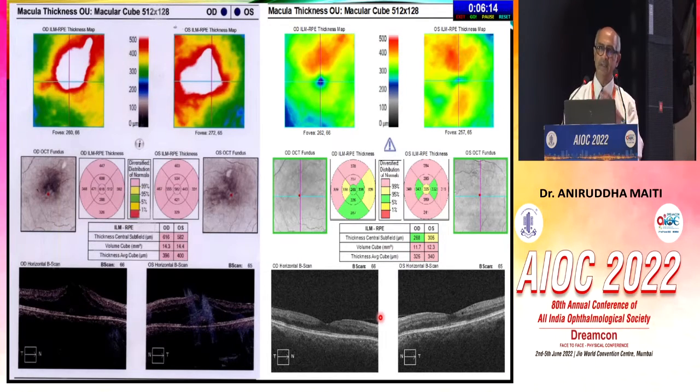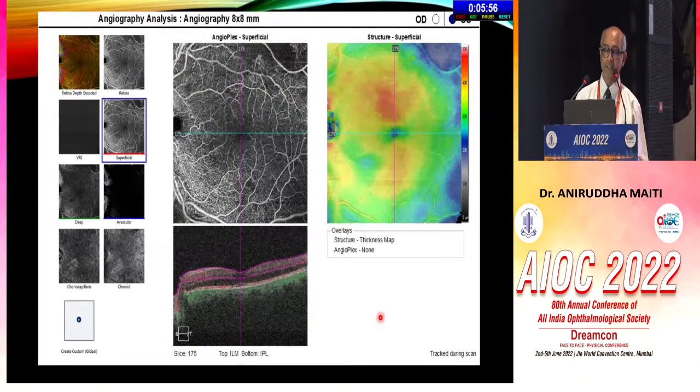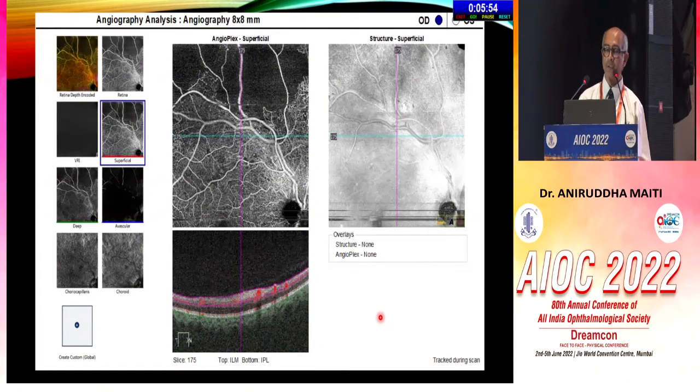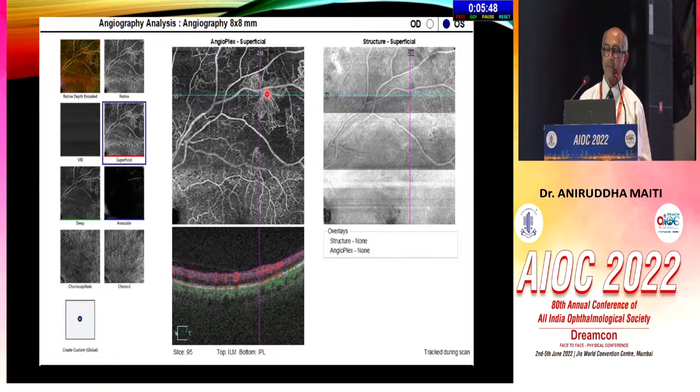I think we've discussed that, but there's still some hesitation in doing this. And also, of course, sometimes you have patients who have known allergies to fluorescein. So I did her OCT angiography, and you can see in the center the retina seems to be well perfused in both eyes, the right and the left. But when moving to the periphery, you can see that there are large areas of non-perfusion. And in fact, in the other eye, one can see that there is early intraretinal neovascularization.